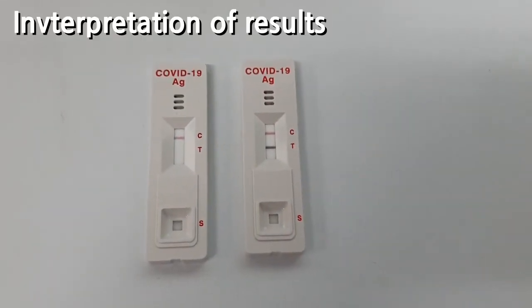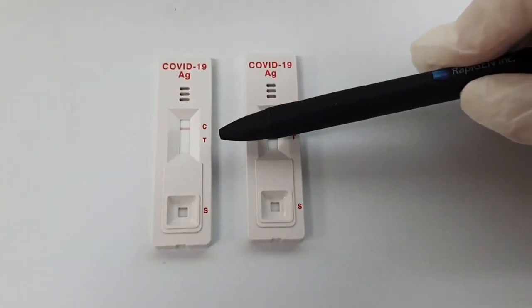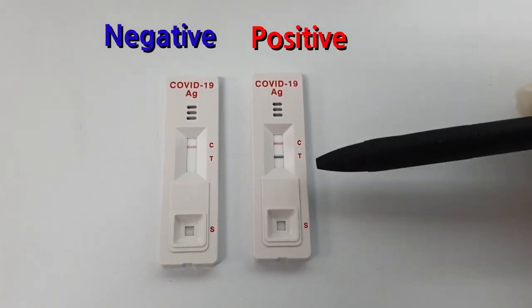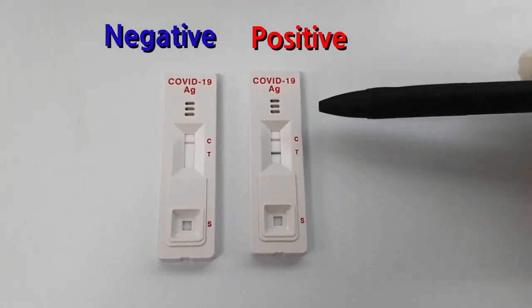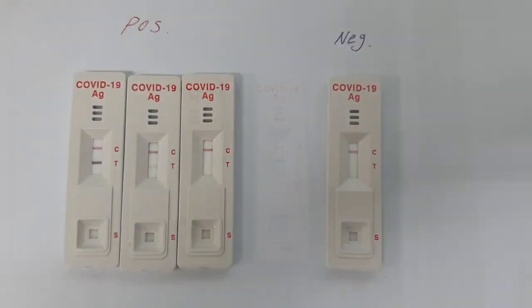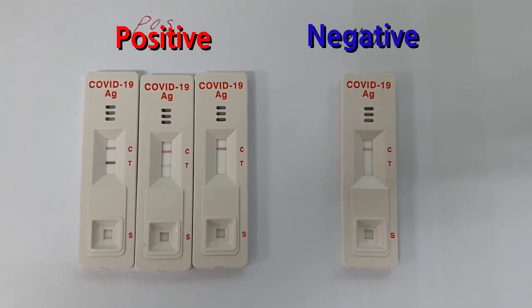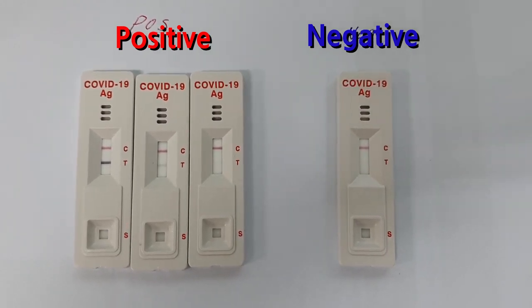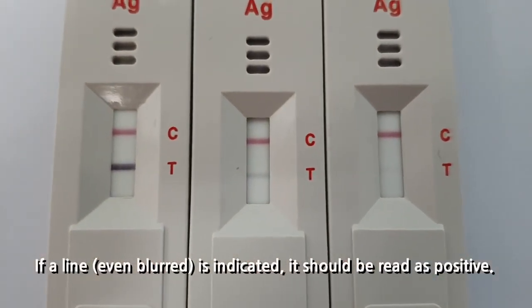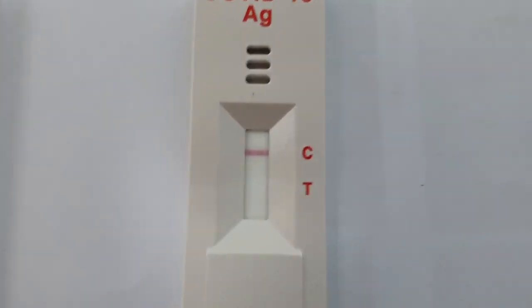Here we have the results. On the left we have a negative result with one red line at C visible within the result window. On the right we have a positive result with two bands: one black T line at the test line, and one red C line at the control line within the result window. If the test is performed too late or too early after a patient comes into contact with the virus, color visibility of the test device is greatly affected. For example, a very weak positive specimen may result in weak color indication. However, if a visible line is indicated, it should be read as positive.